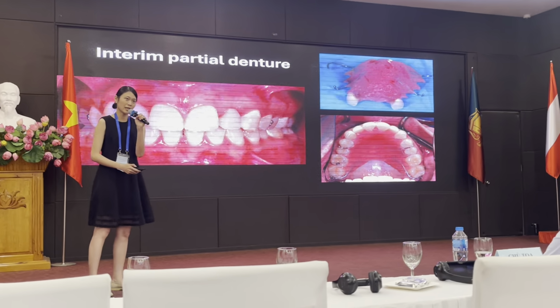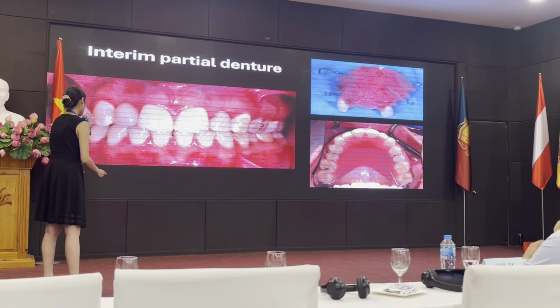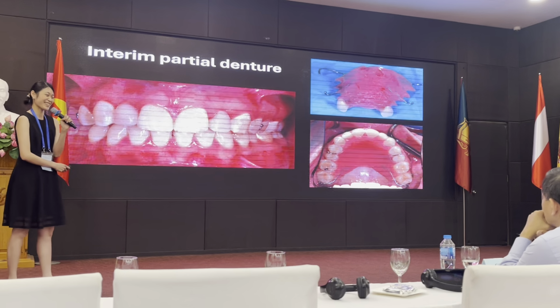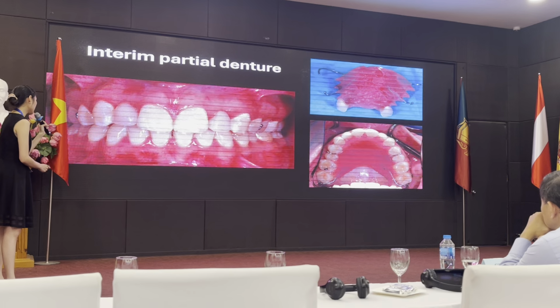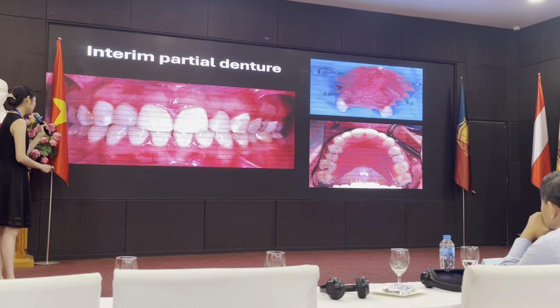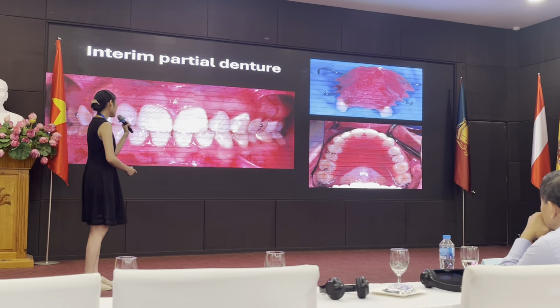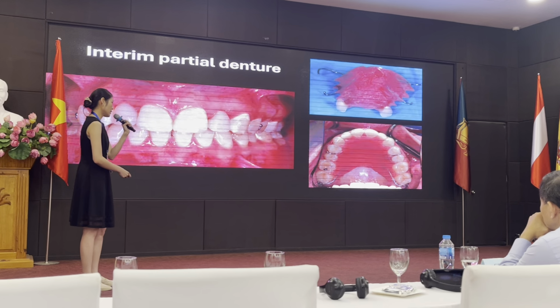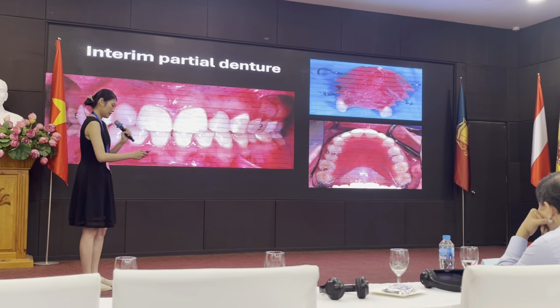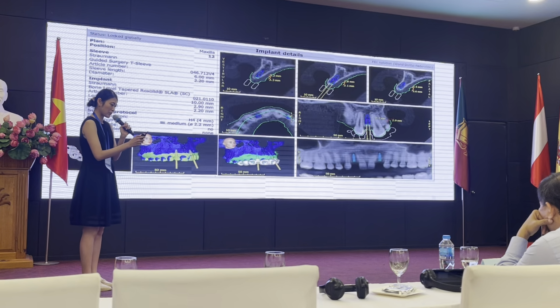And the next thing I did was the interim partial denture, because this patient is very young, so we want something she can smile with. So first we deliver an interim partial denture, and I try to evaluate the future gingival margin that I wanted to be. And also the good part about this is you can utilize this and do the dual scan. So that's what we did.